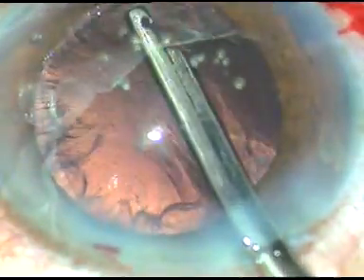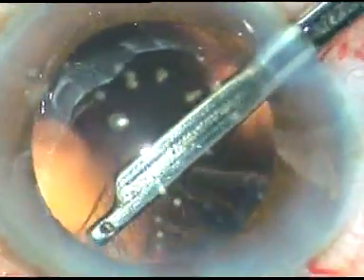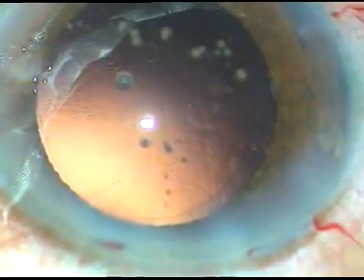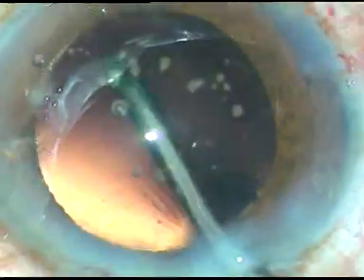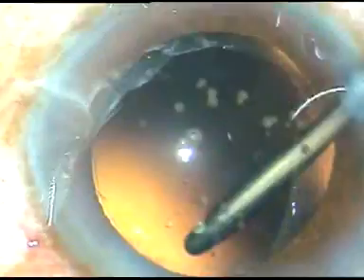Now this cortex is being removed using a Simcoe cannula — this is a 23 gauge Simcoe cannula, and it goes through the side ports very easily. Some cells are sticking to the posterior capsule. I ask for the irrigating probe and I just sweep the irrigating fluid over the posterior capsule very gently, and thus the cells get dislodged and the posterior capsule becomes clean.